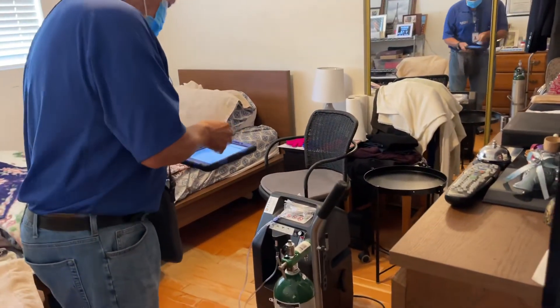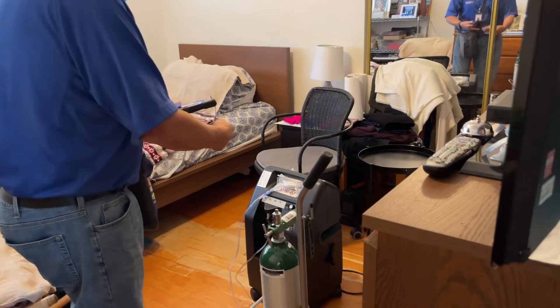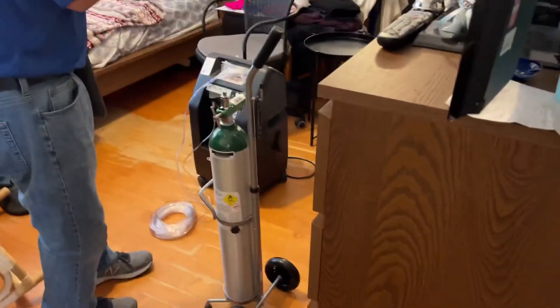Any questions so far? You explained everything so well — beautiful, thank you so much. Let me just scan everything so I can get the serial number and the item number for everything.